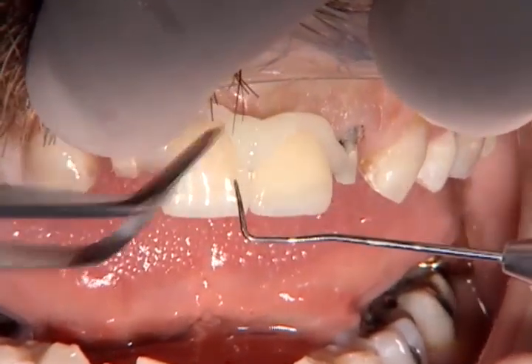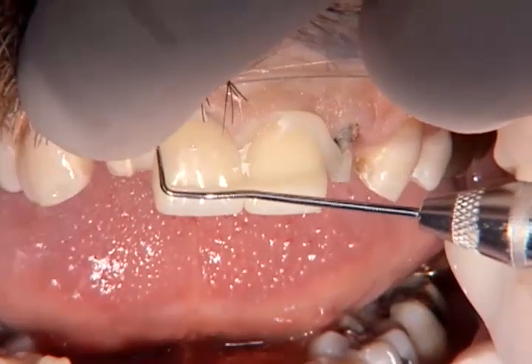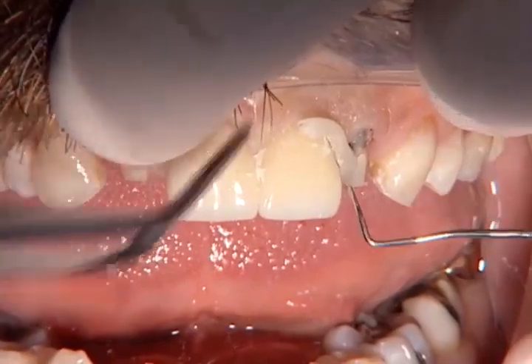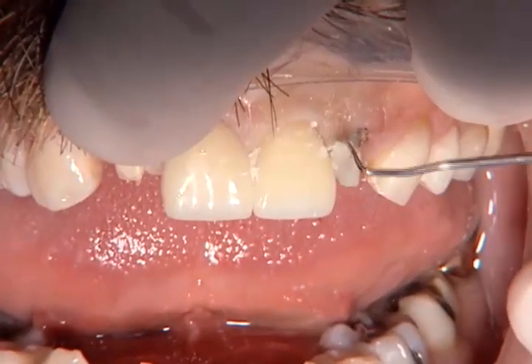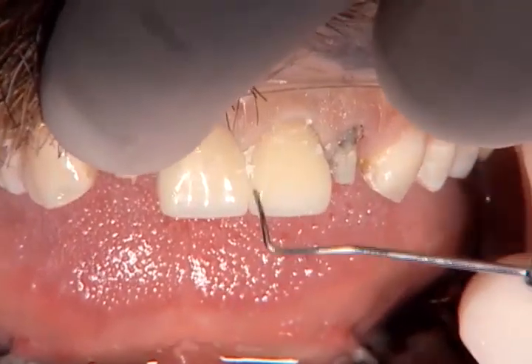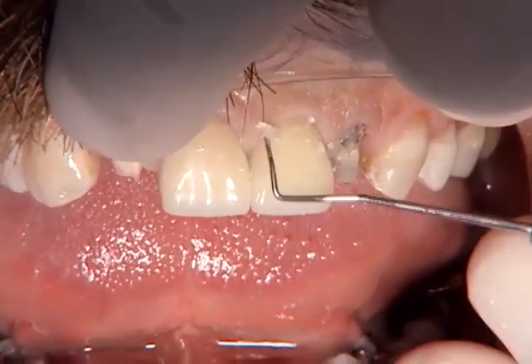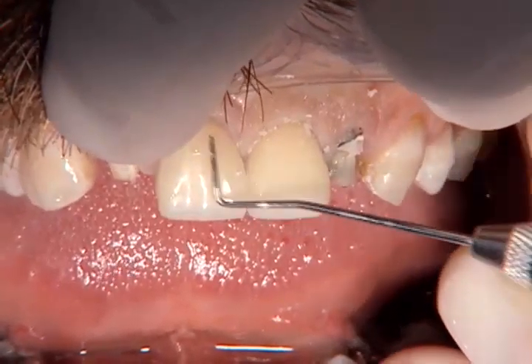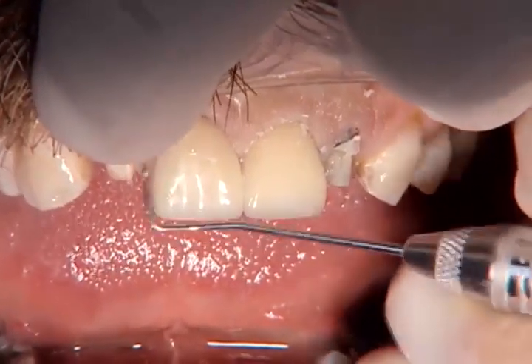I honestly could have used RelyX Luting Cement Plus, and it would have been a really good choice for this. I just wanted you to get a chance to see the Unicem. The Unicem may actually be a little bit of overkill for these crowns, but it's not a big problem. I think the crowns would have done fine with the RelyX Plus Luting Cement, but now you get a chance to see how this self-etching resin cement handles.